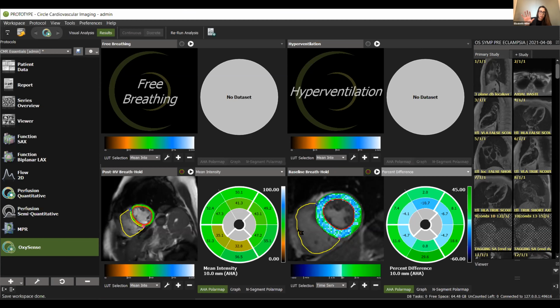But in the end systolic phase, which I've shown here, I can say quite confidently that we know in healthy people, we have 200-300 healthy people that we've analyzed now, and Kate Lindsay, who presented yesterday, is going to publish on the normal values of that. These are very specific to the end systolic phase. So it's a good point.